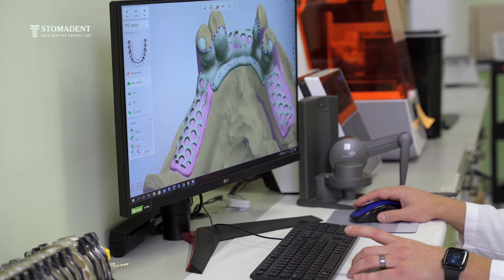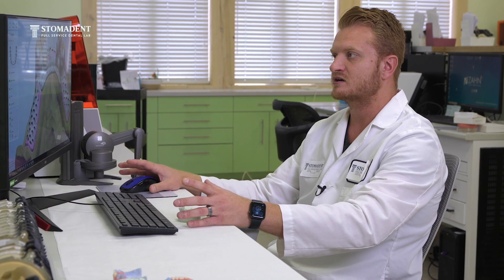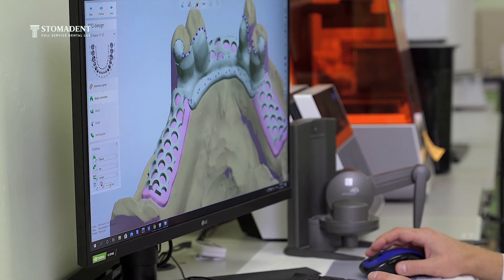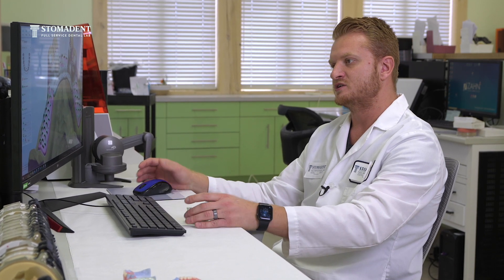The good thing about digital design is being able to work on specific areas in different ways — whether you want one clasp to be thicker than another, or if you want your mesh to be thinner in the anterior segment of the partial compared to the posterior because of lack of space — you are able to do that.